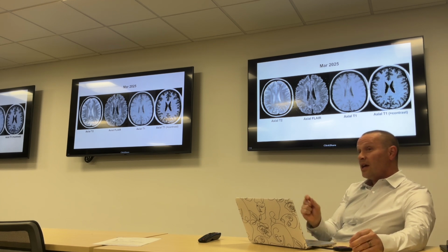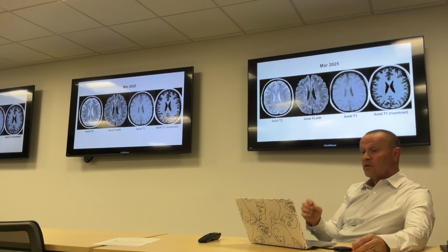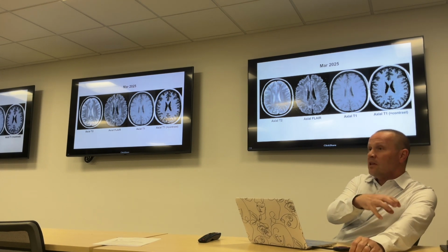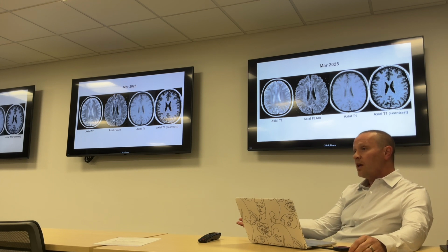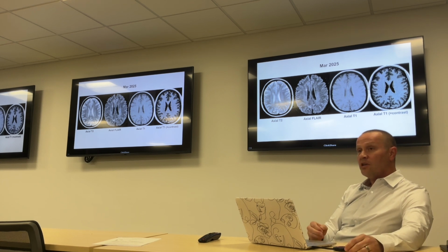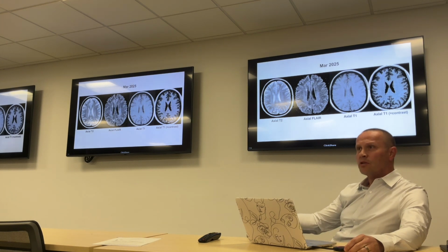Once they're there, that part of the brain is damaged. It's irreparable. It's not going to get back to normal. The enhancement that's initially there, just like the redness and inflammation around the cut on my arm disappears, the acute inflammation also disappears, so the enhancement will go away over time. It's a little different for every lesion in every patient, but the inflammation will typically go away over a few weeks. If we brought them back 3 weeks later, most of the time it'll be gone or a lot less.